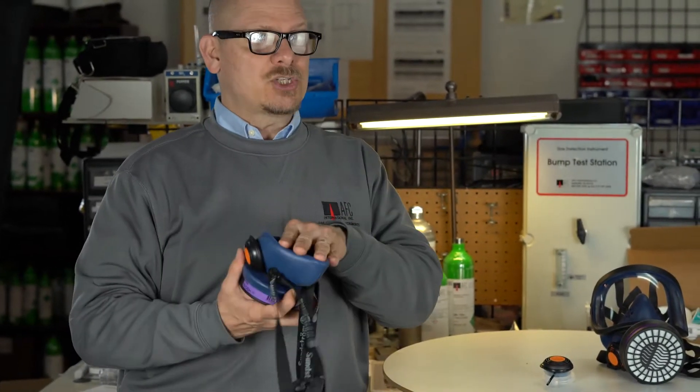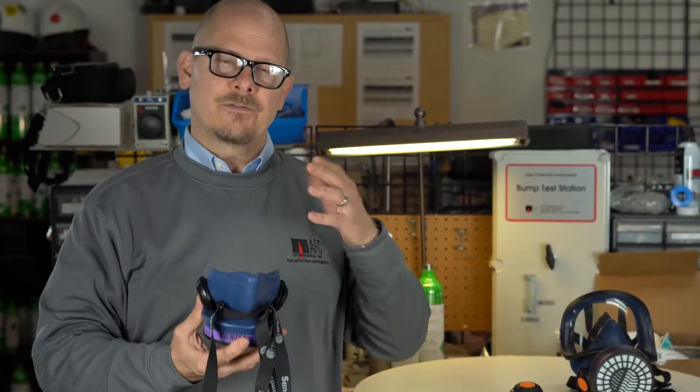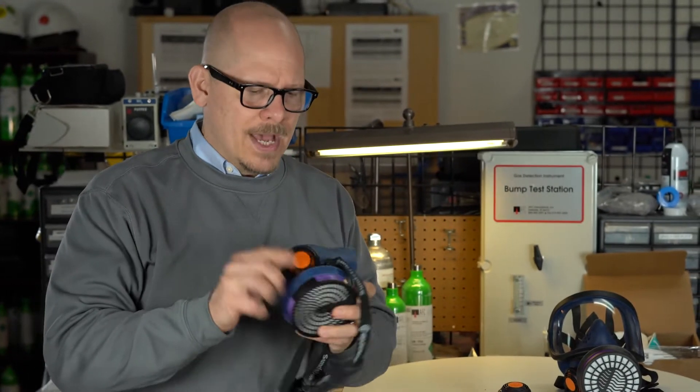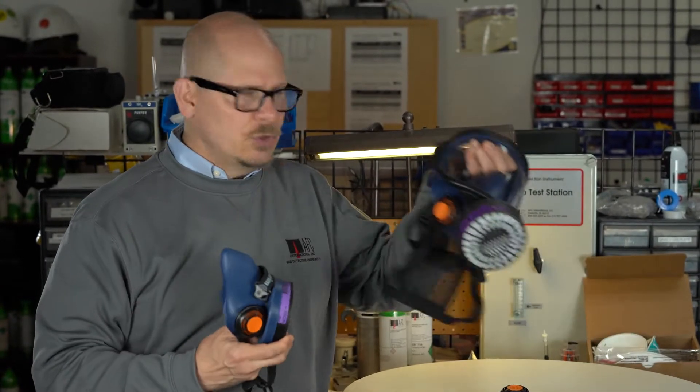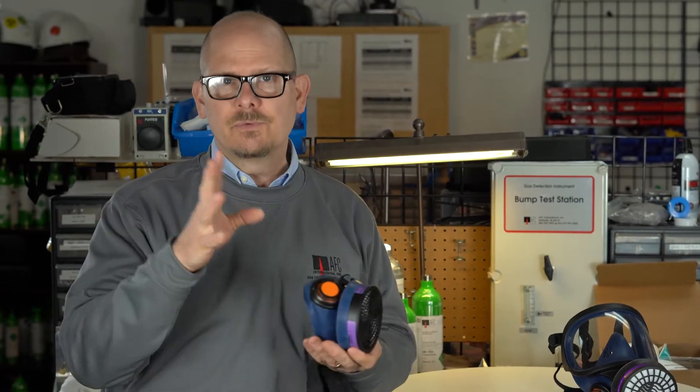Best fit might just be mask changes or mask sizes. It also could be the way you're putting the mask on — the procedures of how you put that mask on. I want to show you how we would prepare an SR200 or an SR100 for a quantitative fit test, and it's really, really simple.